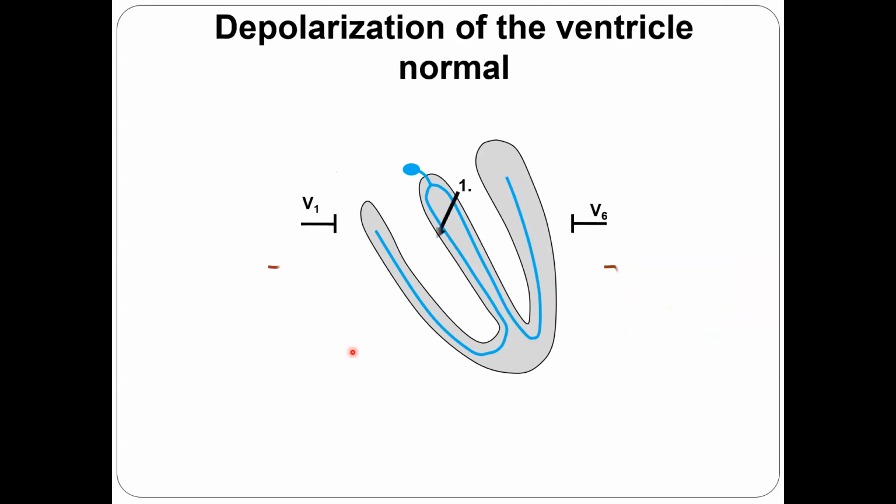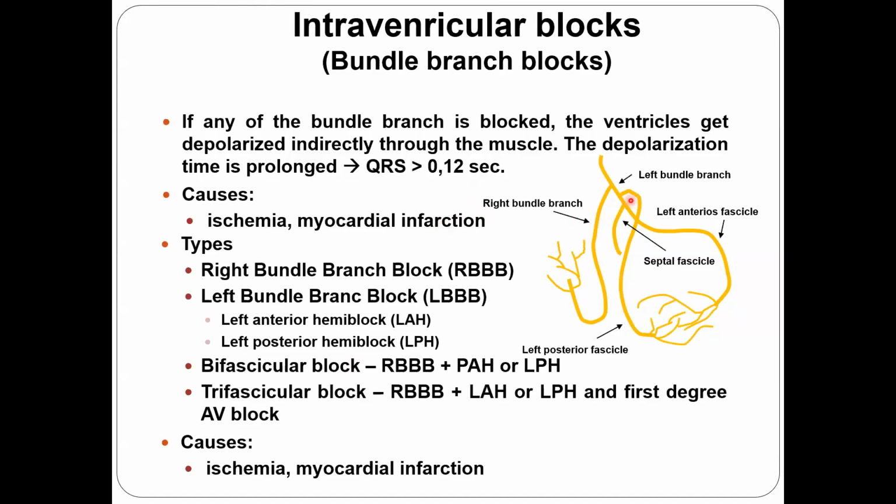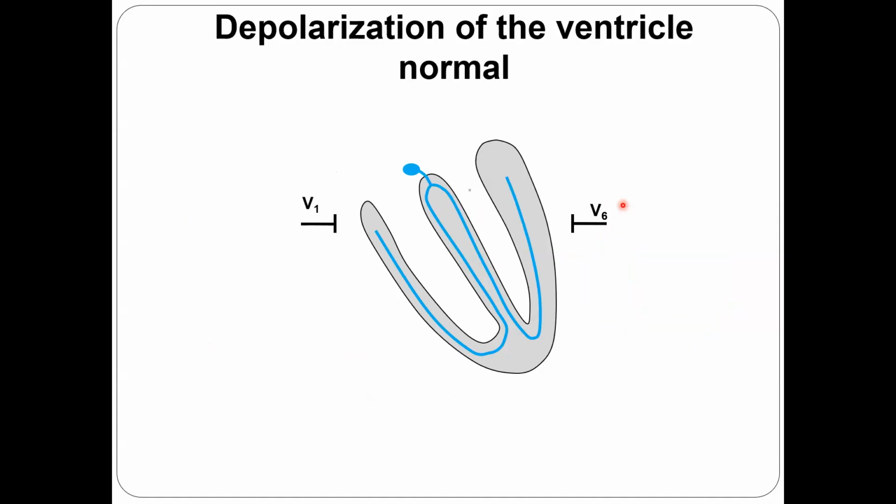go and summarize how the ventricle is activated normally. First of all, we learned that the septum is activated from the left bundle. If you are looking at, for example, the septal fascicle here, the charge comes about 90% from the left bundle. That's important. That gives us a little positive wave, a little initial R in V1, and a negative Q wave on the left side in V6.